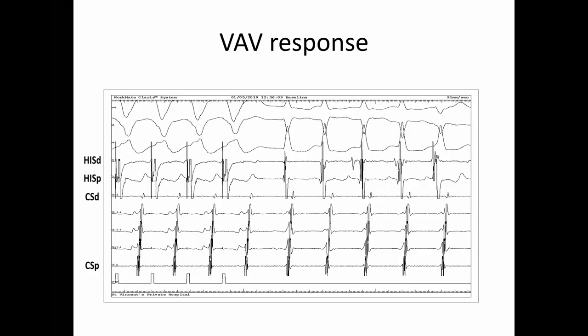So this is just taking you through a few entrainment examples. And this is really the critical maneuver in a lot of electrophysiology, which is why I'm laboring the point, sorry. And you can see on the right-hand side of the screen, we've got a SVT, it's narrow complex. The VA relationship is 1:1. And you can see here, we've delivered extra stimuli. You can see the extra stimuli are coming from the His catheter, and we've got ventricular pacing, you know, QRS morphology.